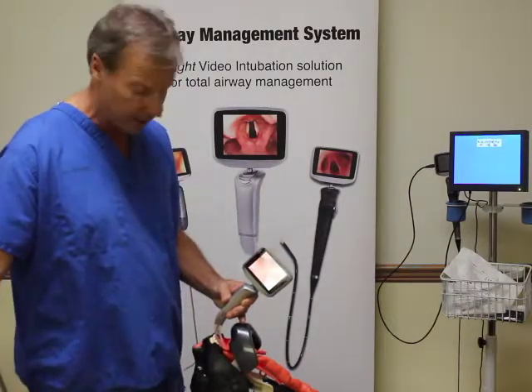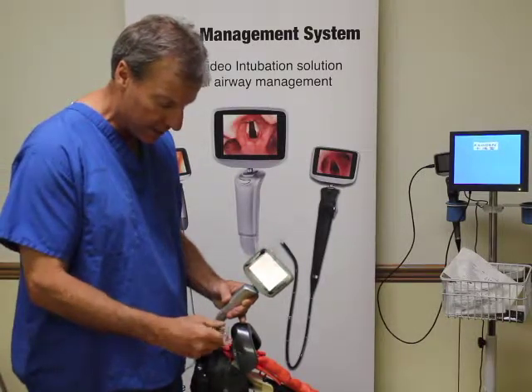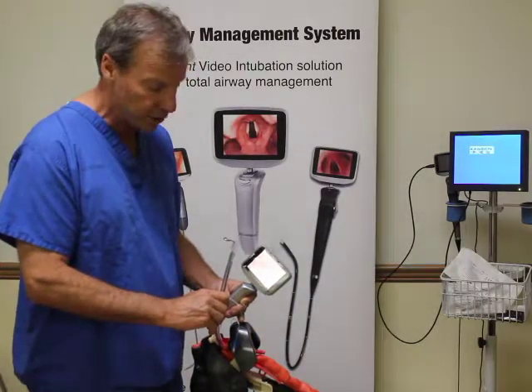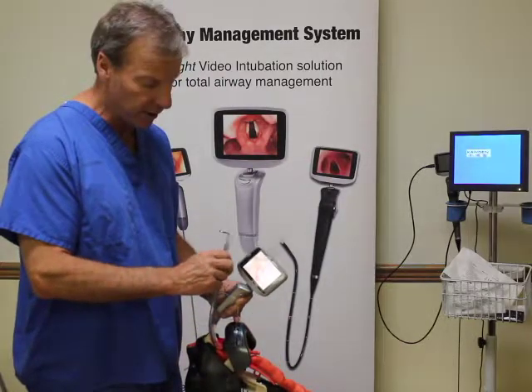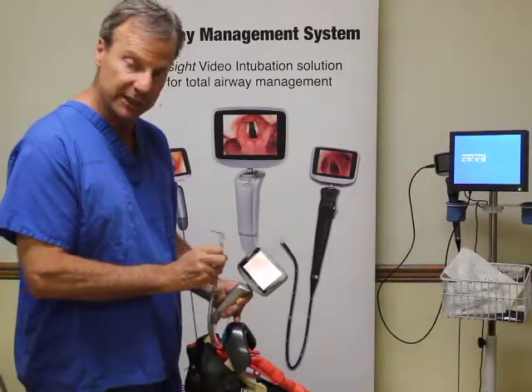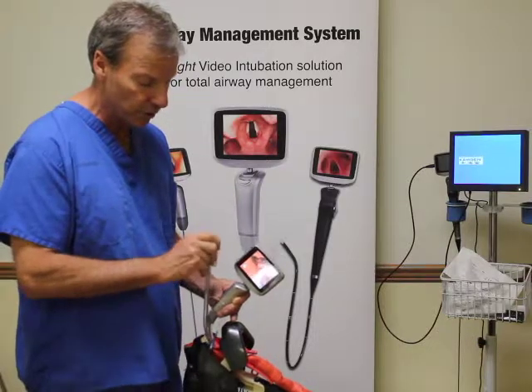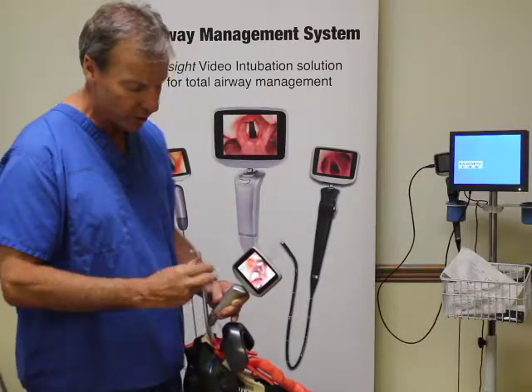I'm going to take my endotracheal tube and watch the patient once again. I go in on the side and then move it in. As soon as I see the tip of the endotracheal tube, sometimes I pull it back a little bit so that you aren't blocking your view. Then I move my hand up so that I can use a slot machine technique to pull it back a little and then advance the endotracheal tube slowly. I advance it and see the endotracheal tube go through the cords.